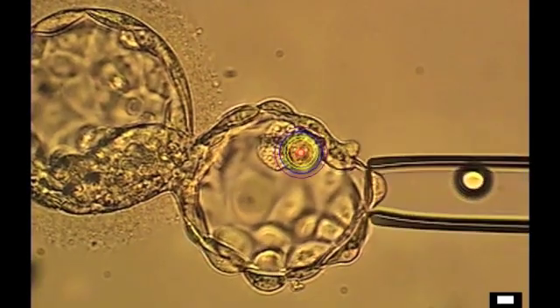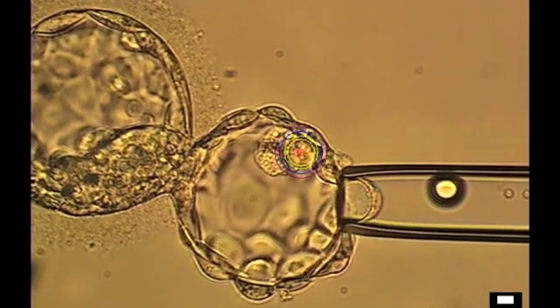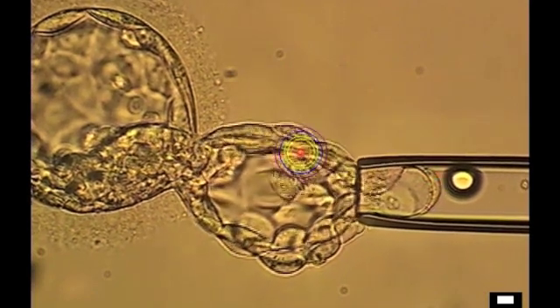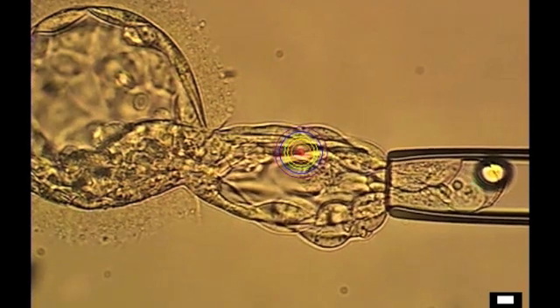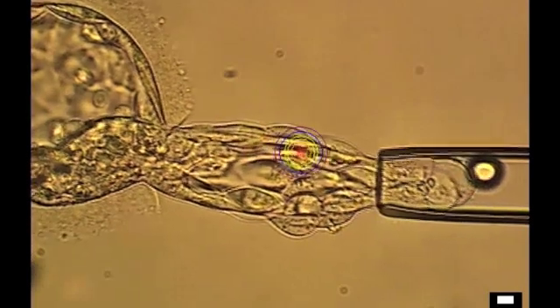This video demonstrates a technique known as embryo biopsy. What you see on the screen is a five-day-old human pre-implantation embryo. A small amount of what is called the trophectoderm is going to be removed and evaluated to see if the embryo is normal.